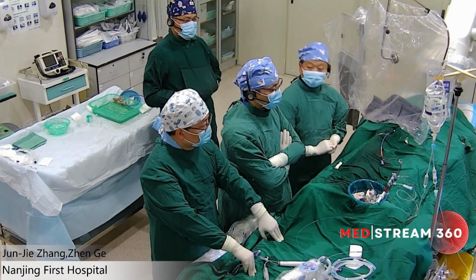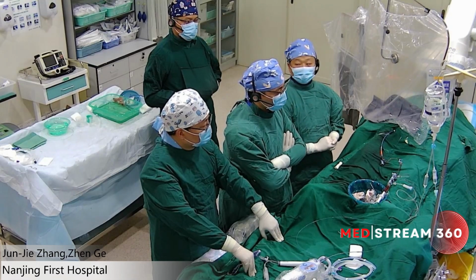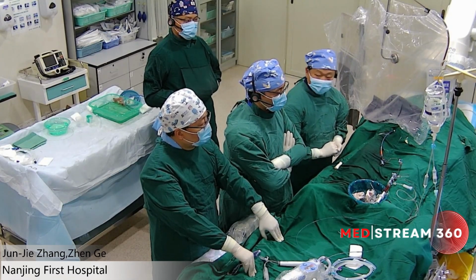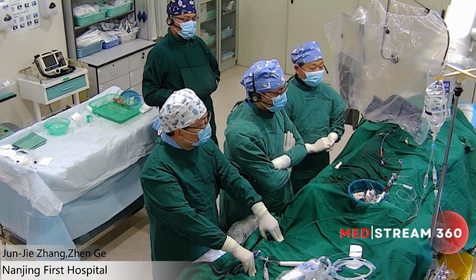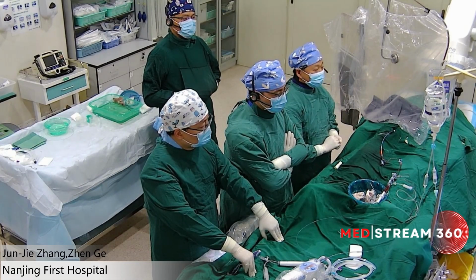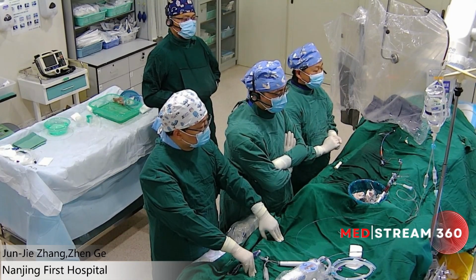On behalf of Professor Xiao Charlie Liangchen, it's my great honor to perform two live coronary intervention cases from our center, Nanjing First Hospital. So please, Dr. Ge, introduce your case.